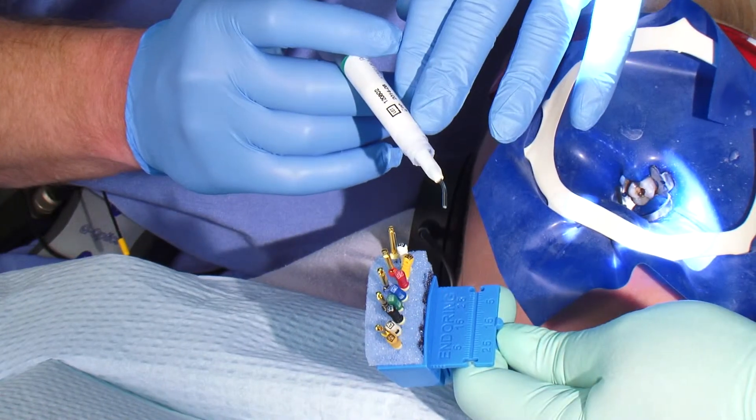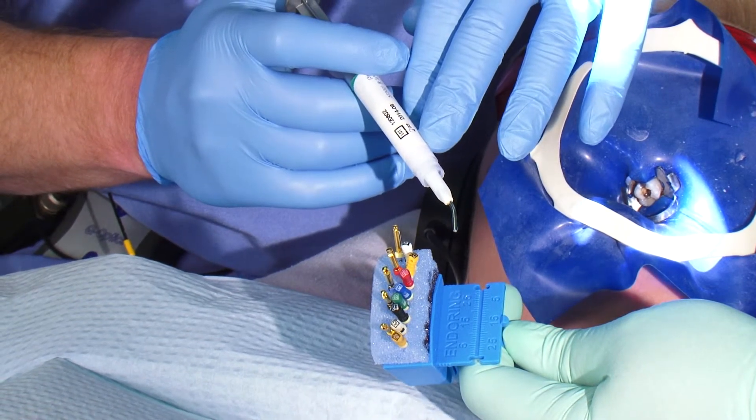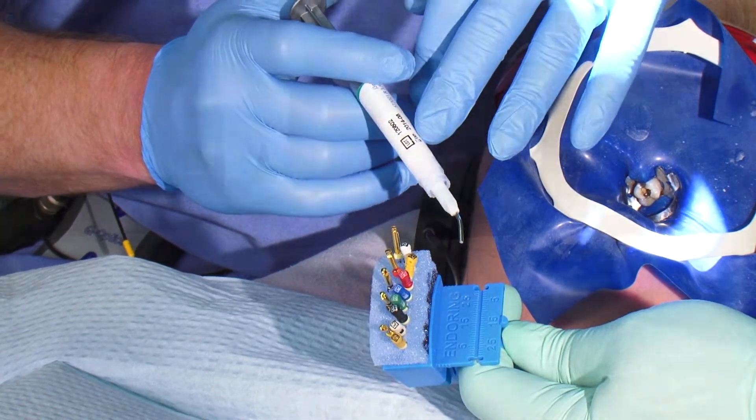Glide comes in these convenient syringes, which make application easy for me and clean up easy for my staff. But I think you will find that it is more than just easy — it might even just become essential for your root canal therapy protocol. Give it a try.